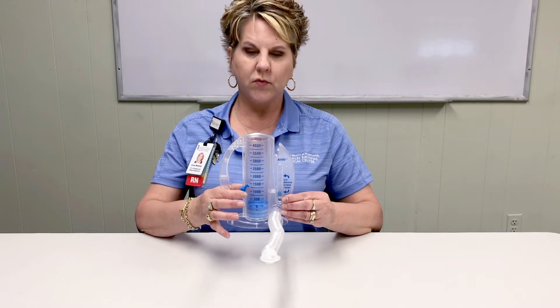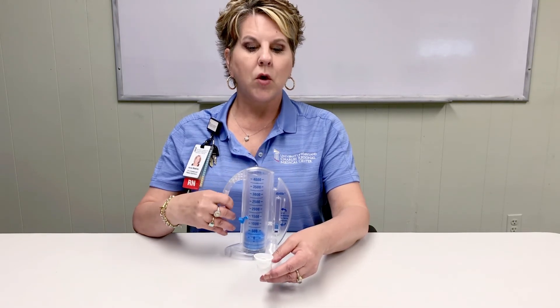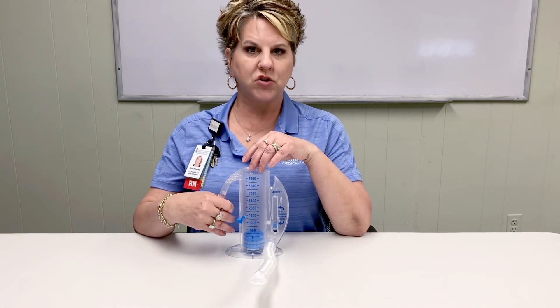Once your piston reaches your goal, remove the mouthpiece from your mouth. Hold your breath for 3-5 seconds and then slowly exhale. You will repeat this process 10 times for each session.